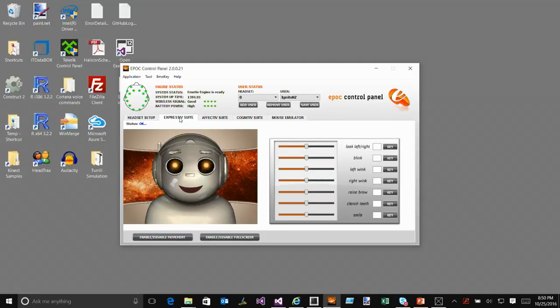So what that means is that EEG data is really, really messy. It's noisy data. So if I make facial movements and that's reflected in there, and I'm taking data to try to determine whether someone's lying or not lying, I don't want these things picked up in my data. Or maybe I do, if they have facial twitches. So just something to keep thinking about, all right? Keep that in mind. That's kind of the early thing, and we'll come back to that.